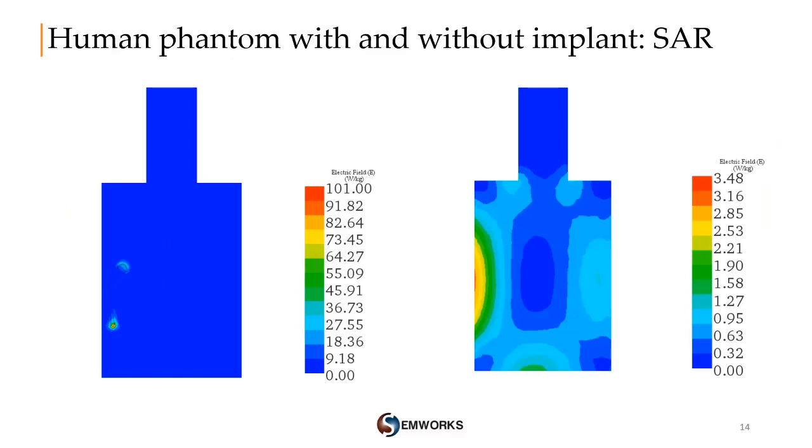Let's now compare the second important results, which are the SAR, the specific absorption rate distributions. As clearly noticed, the presence of the metallic replacement highly affects the human tissues by increasing the rate of absorbed energy inside them, which is converted later to heat around these implants. The obtained local SAR distribution exceeds the limits defined by ASTM norms.